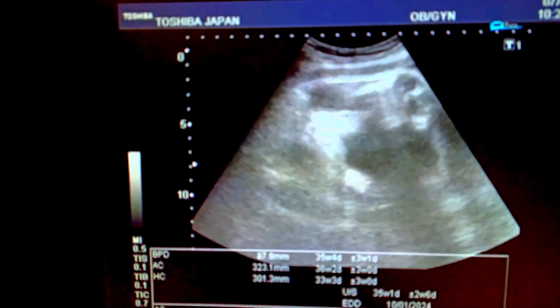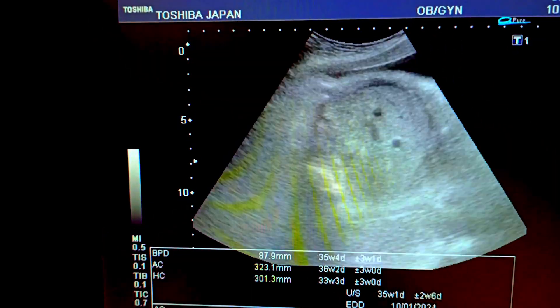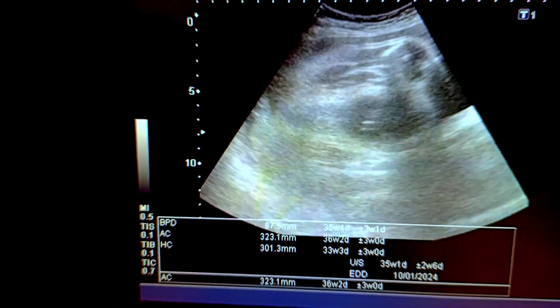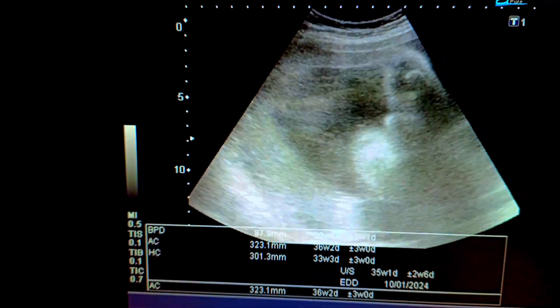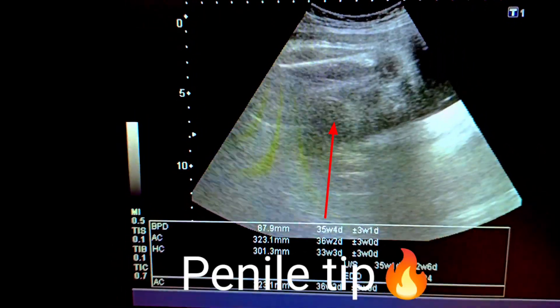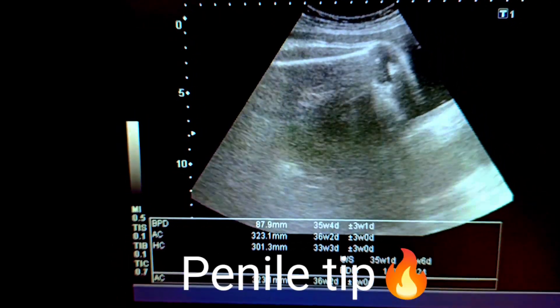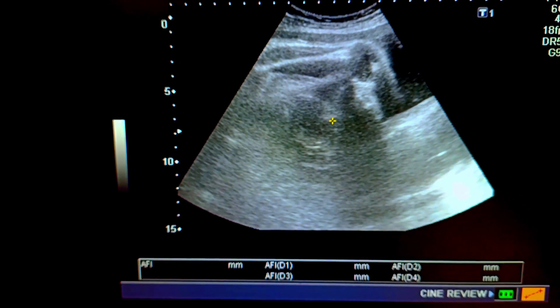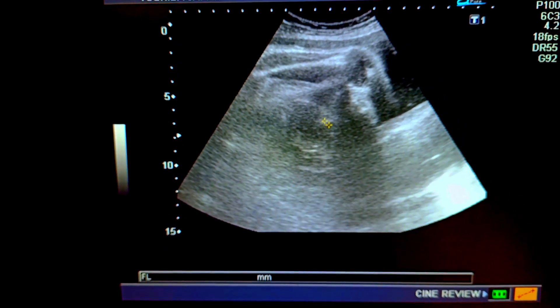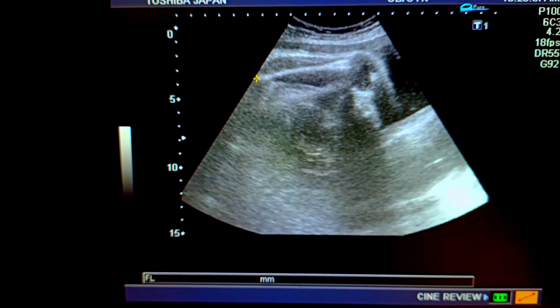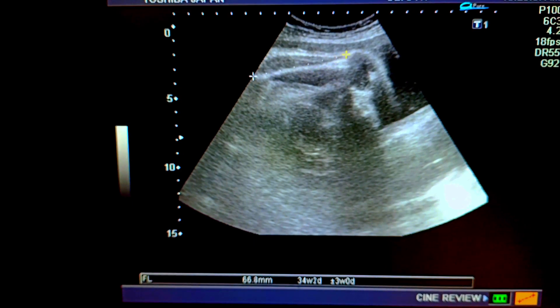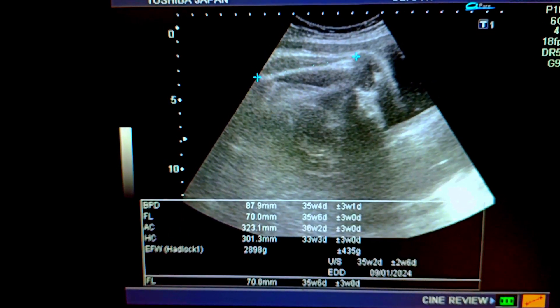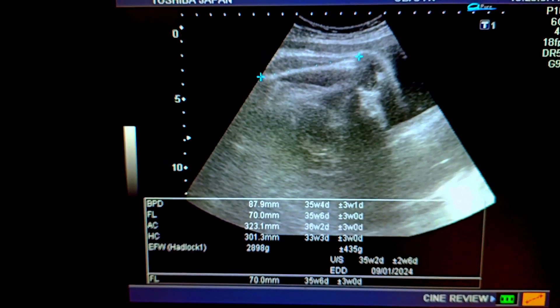Now we would like to measure the femur length, which also corresponds to 36 weeks. You can see the penis — that is very clear in this case — which we used to determine the gender in this particular case.